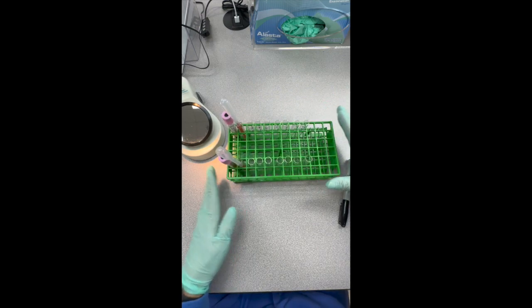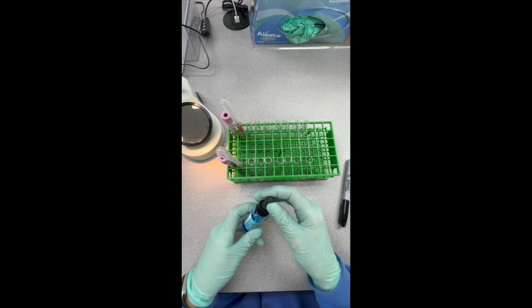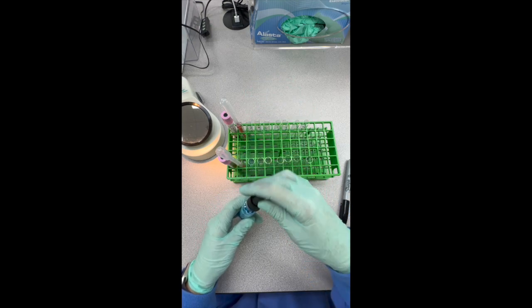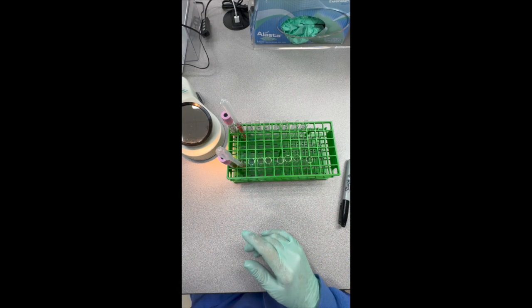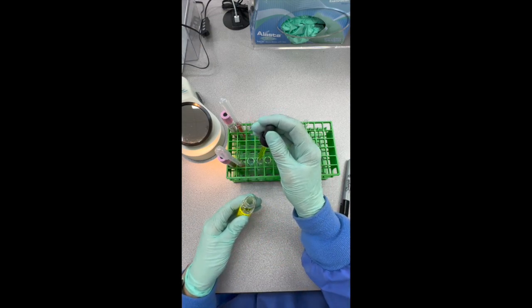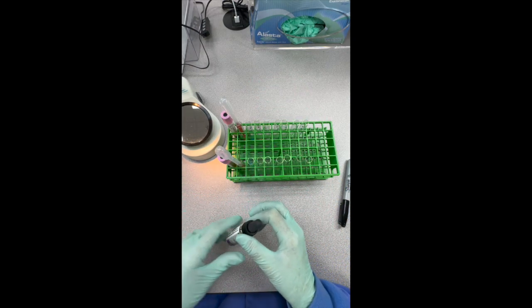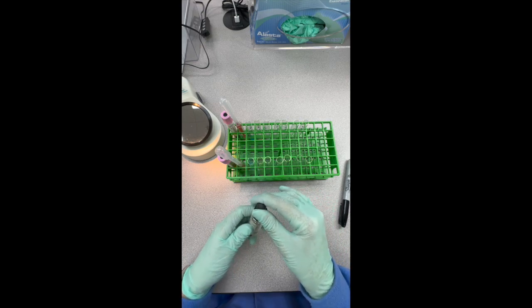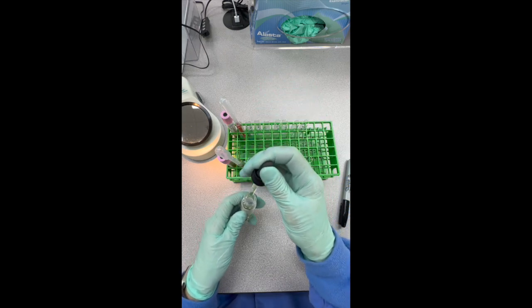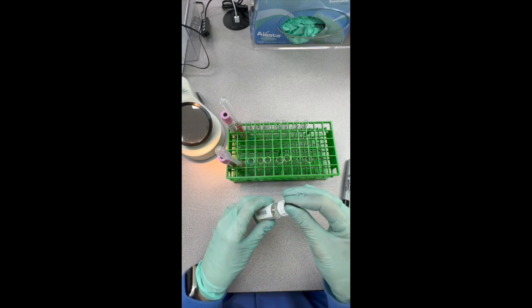As we go across here, get my reagents, nice little mix. One drop of our anti-A in our A tubes. This is for our front type on these patients. Anti-B. Here's our anti-D we're going to add. Here's our control.